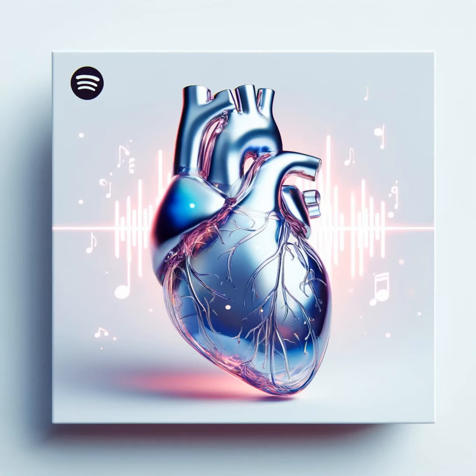There are absolute and relative echo contraindications to LVAD implant. Smaller LV cavity, defined as a left ventricular end diastolic diameter less than 6.3 centimeters, is associated with increased 30-day mortality after LVAD implantation, but it is not an absolute contraindication to LVAD implantation. Intracardiac thrombus is not an absolute contraindication to LVAD implantation, but it may increase the risk of stroke during the LV cannulation portion of the procedure.